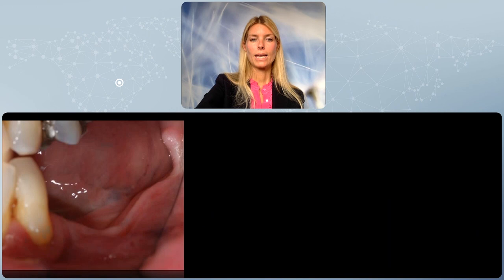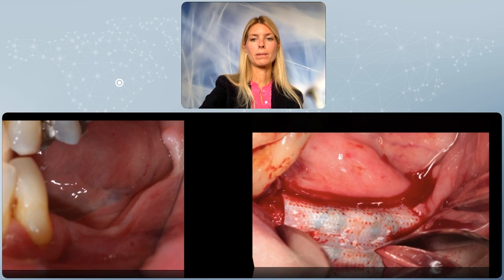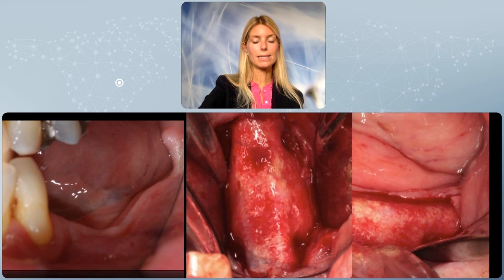Kay is another patient that was referred to me for a previously failed posterior set of implants. As you see, the patient presented with a very thin, narrow ridge with only 1 millimeter of keratinized tissue on top of the ridge with a vertical component. The regeneration was performed, and 9 months later, we were able to regenerate a beautiful, large, wide volume of bone where implants could be easily positioned. And I would like to highlight the vascularity of this regenerated bone, which is highly important.